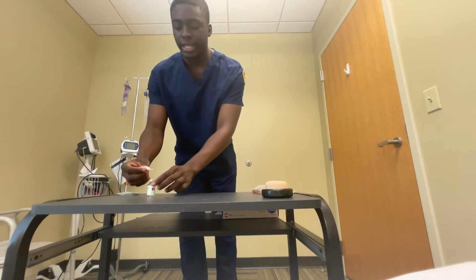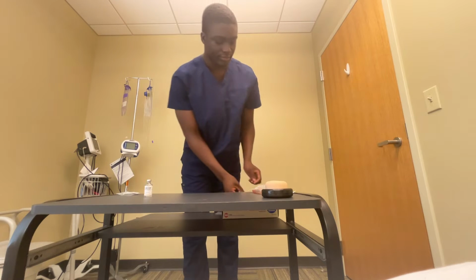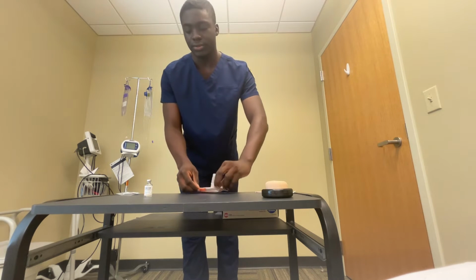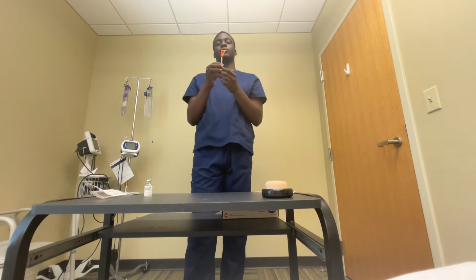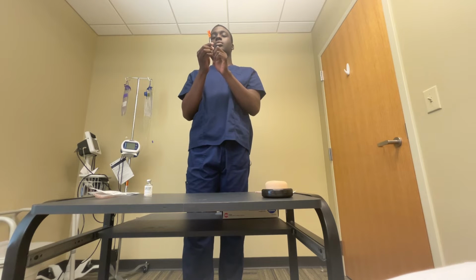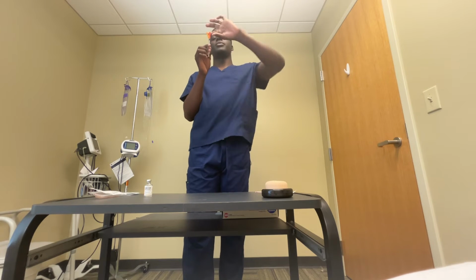Then I will collect one of my alcohol prep pads. Wipe the cap. Let it dry a little. Take my syringe. Draw 10 units of air. Remove my needle.